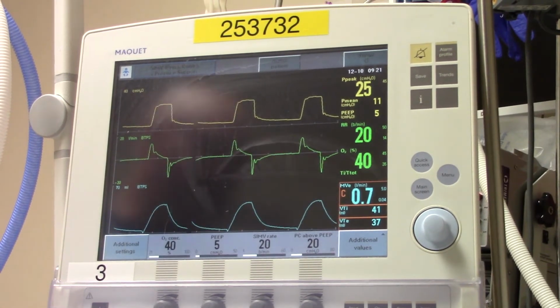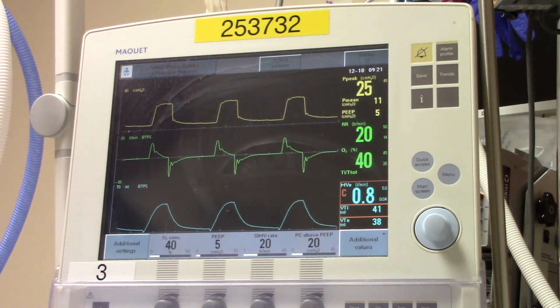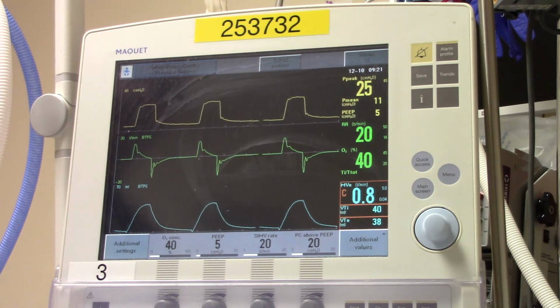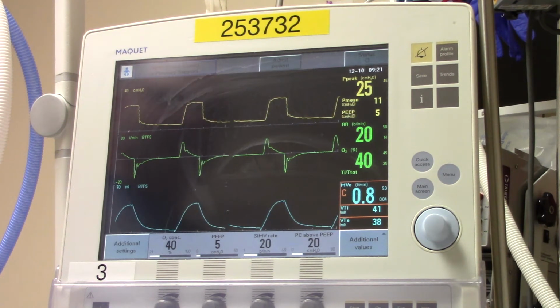Okay, today let's talk about lung inflation therapy. What we're going to do is look at the difference between doing lung inflation therapy via an inspiratory hold on the vent in the current mode of the patient versus switching to our new procedure of switching to CPAP for 30 seconds.